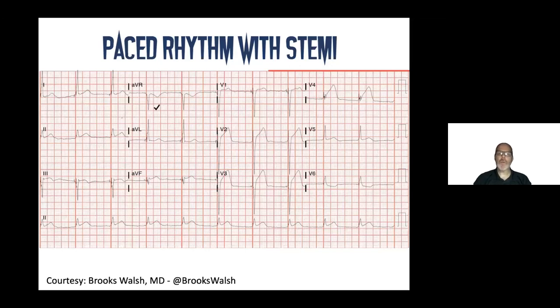How does this whole thing work with paced rhythms? Well, remember, it's a right ventricular pacer, which means that the right ventricle is going to depolarize first.